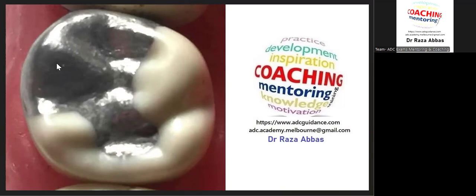And then we see certain candidates, once they're done with the restoration, everything seems to be good, but then there are ditches, open spaces at the tooth restorative junction. Now, once you're done with the task, you have scrap amalgam, right? Maybe with you in the cup that you're using to place the scrap amalgam, or maybe on the tooth or the gums. Pick up that scrap amalgam, place it in that ditch, and then press it with a ball burnisher. That ditch or gap you have will automatically go away. So you see, these things you need to work your way out.